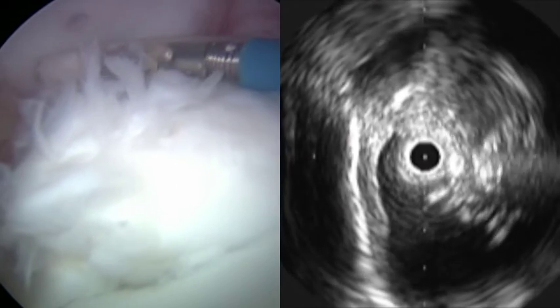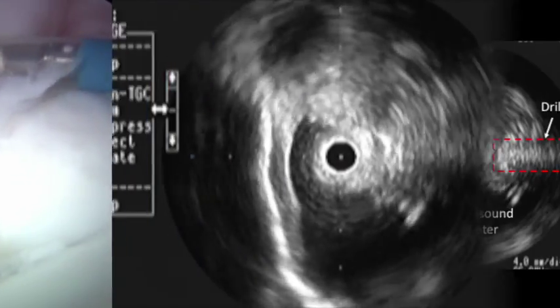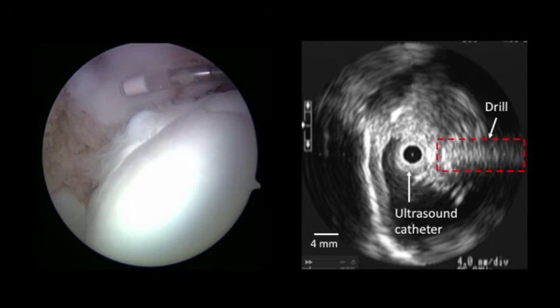Ultrasound guidance of retrograde drilling was possible. The drill can be seen in the right-hand side of the ultrasound image. Ultrasound provided real-time information on the location of the drill beneath the cartilage surface and thus enhanced the control of the subchondral drilling. The ultrasound arthroscopy technique may give new possibilities for precise diagnostics and treatment in hip cartilage lesions. Further patient series are needed to confirm the applicability of this promising technique.